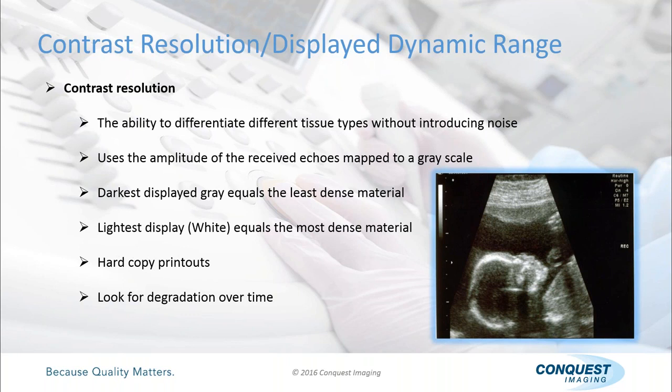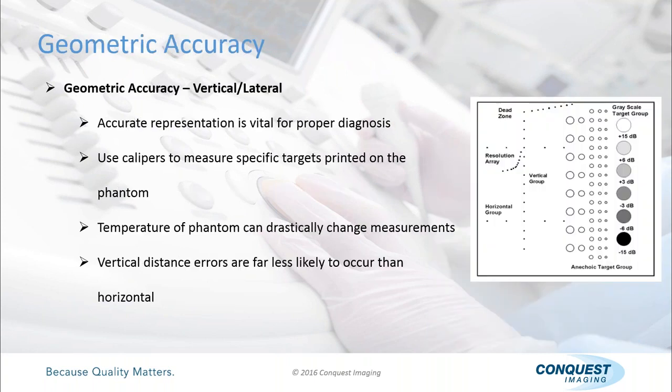And I can't tell you how much nicer it is to have something like that to evaluate than nothing at all. If you have nothing at all, put it back on your technologist, on your sonographer to show you images of when they said that the image was good versus what it is now. But in either case, having something to compare it to will really benefit you when troubleshooting image quality issues.